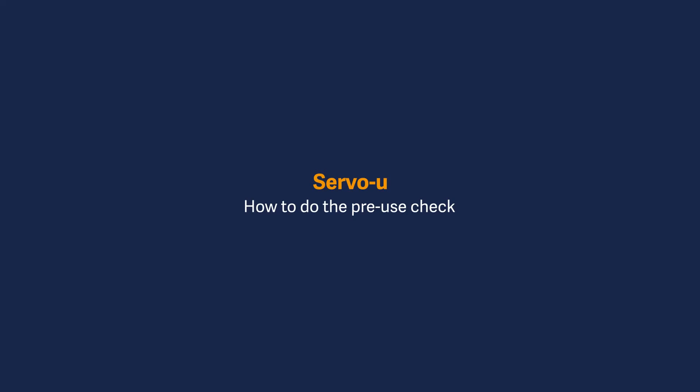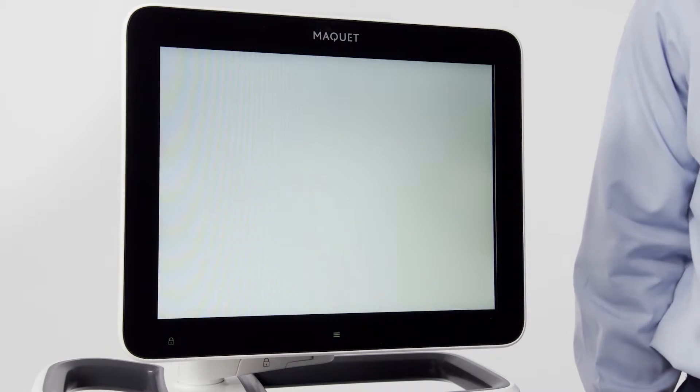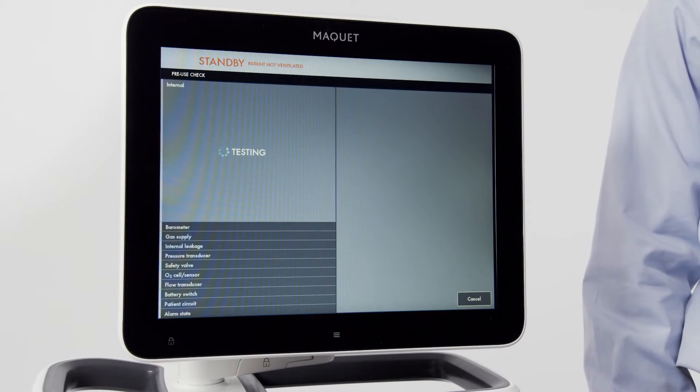Upon startup, you will be prompted to run a pre-use check. The pre-use check takes approximately five minutes and should be run between patients. To activate the pre-use check, press yes on the screen. You will then be prompted with illustrations that will guide you through the startup.